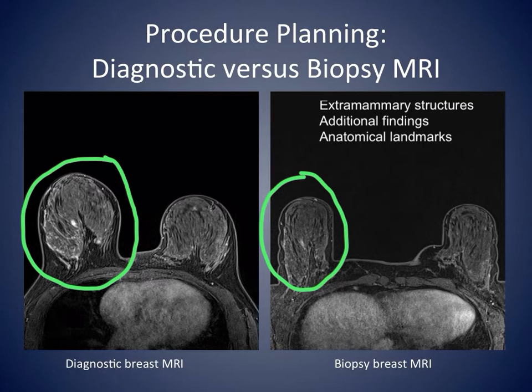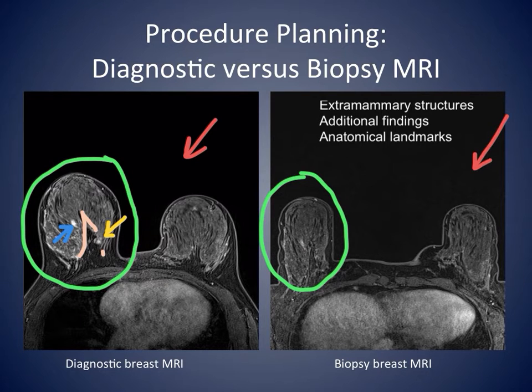The diagnostic breast MRI on the left shows the enhancing lesion to be targeted in the center of the right breast, close to the edge of the breast tissue and retromammary fat. It also shows a few enhancing foci posteriorly in the same slides. The MRI with the breast in the grid on the right shows the lesion more vague, confirming the anatomy of the breast parenchyma and retromammary fat and identifying the small enhancing foci. Extramammary structures such as the heart, chest wall, and liver can also be used as anatomical landmarks, keeping in mind differences related to positioning and respiratory phase.